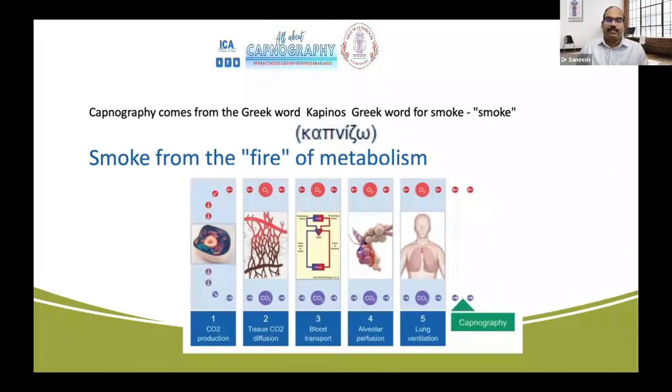Those who are closely monitoring the patient's immediate post-op will realize that oxygenation might be seen normal, but the patient may be accumulating carbon dioxide. So the patient may become drowsy because of carbon dioxide accumulation, because you are underrating carbon dioxide metabolism, which is very vital for all living beings.